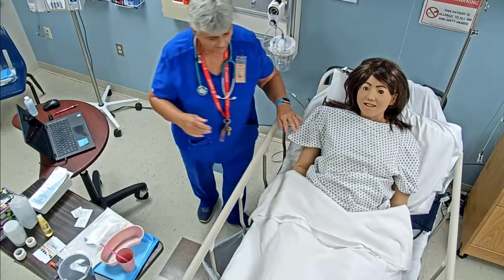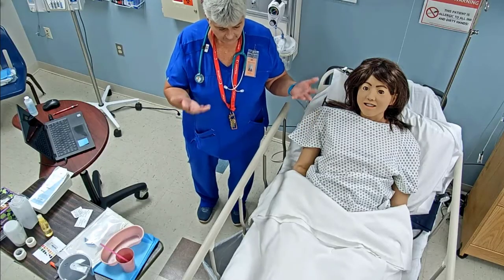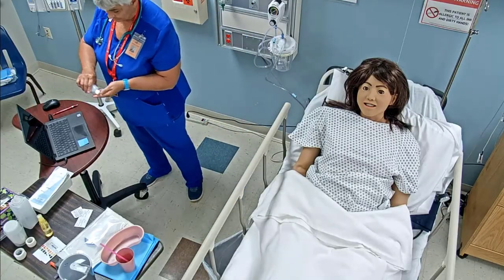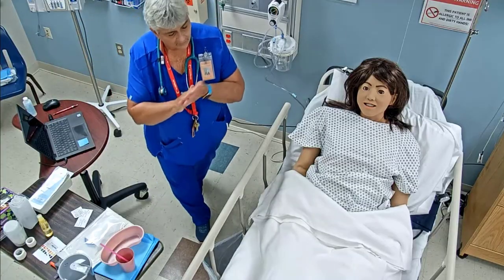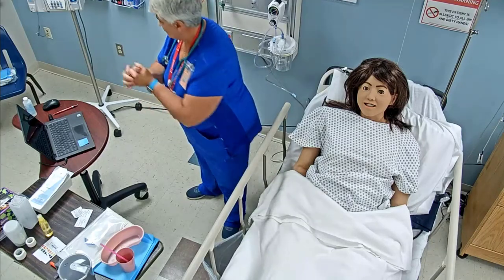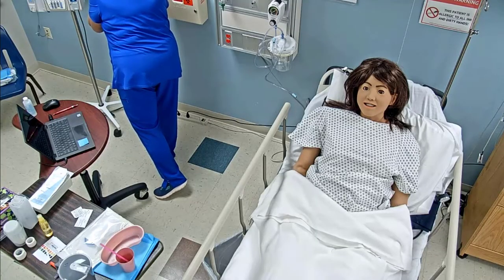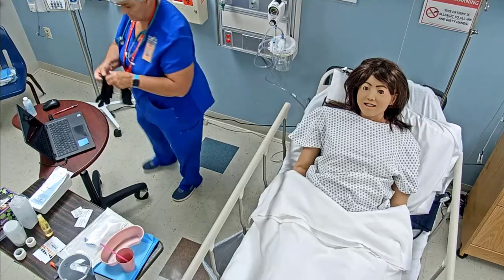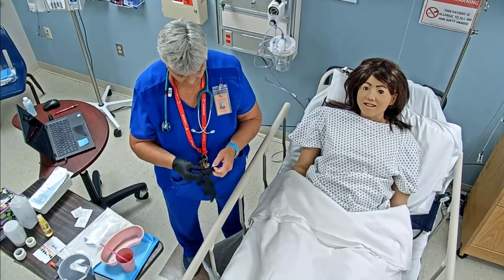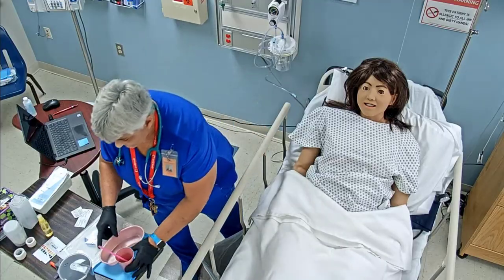All right, if I didn't have gloves on to begin with, then I'm going to go ahead and put gloves on now. We've already done our medical hand wash. And I'm going to put on clean gloves. Are you doing okay? Good. Okay, just a few things I've got to get set up.